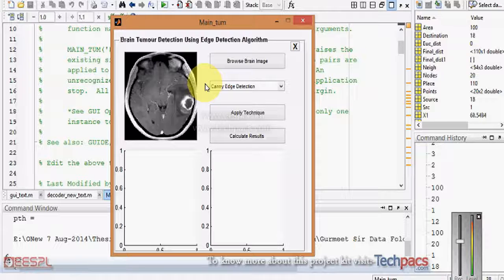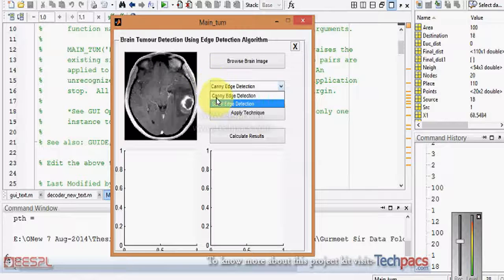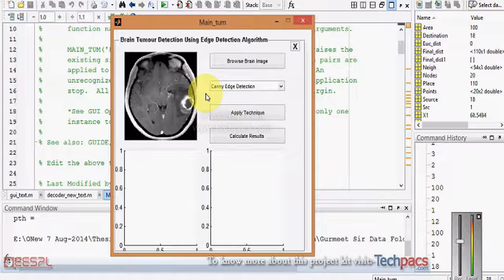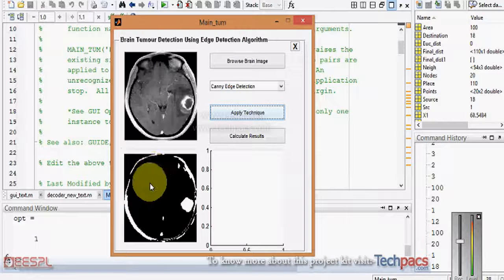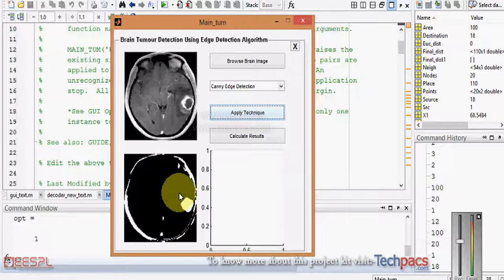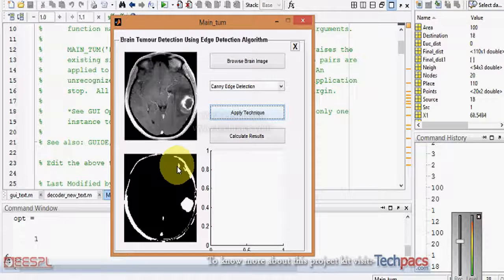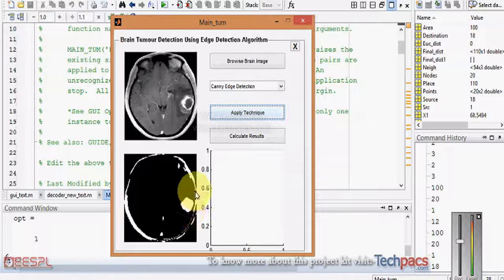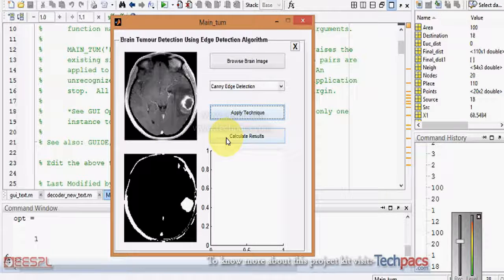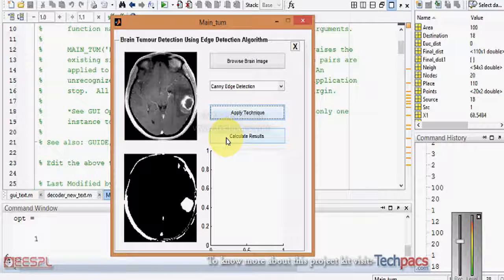When I am selecting the Canny edge detection, and then applying that particular edge detection technique on it, it will show me the results with the edge detected. The next section is to particularly highlight that section which is having the tumor in the image, which will help the doctors or other analysts who can further proceed for rest of their scenarios.